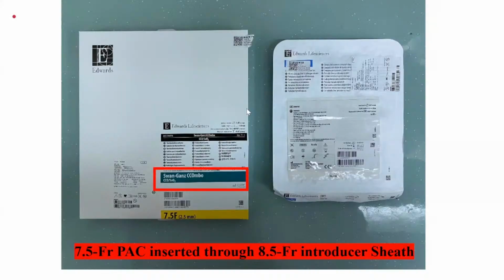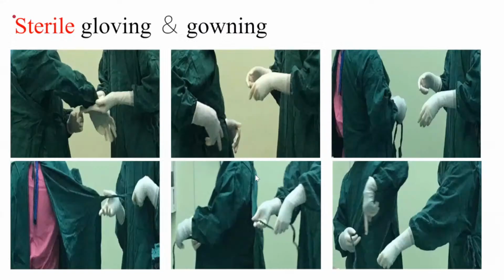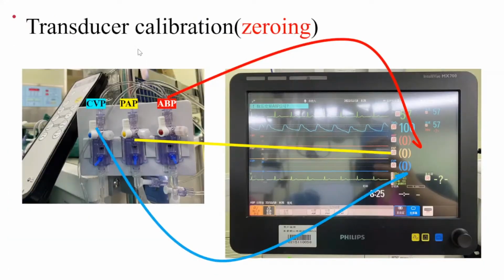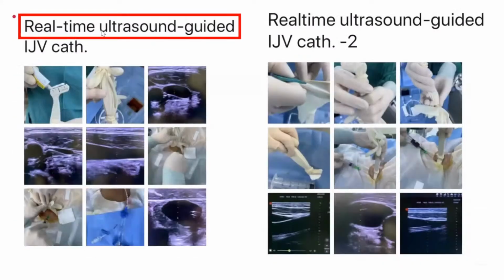PAC insertion and setup. This is what we use at Fuwai Hospital: 7.5 French PAC and 8.5 French introducer sheaths. After removing the package, they look like this. Sterile techniques are used when inserting a PAC. The transducer is calibrated beforehand. And in addition to the anatomic landmark technique, ultrasound pre-location and real-time guidance techniques are used.